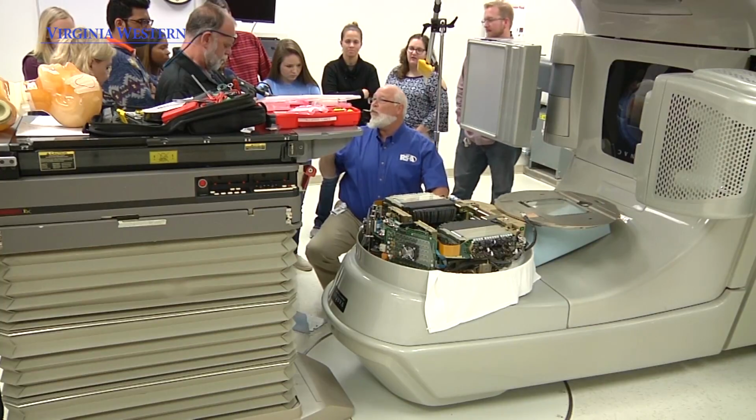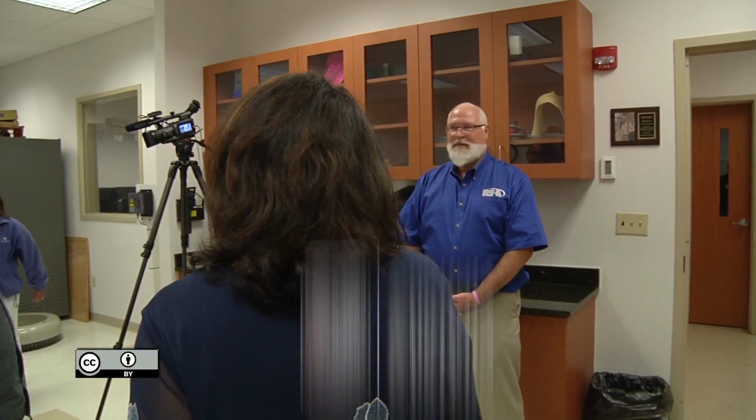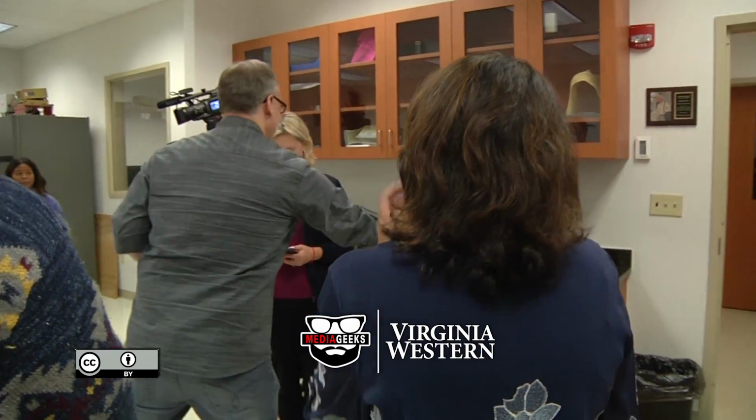Okay, who wants to hit WR on the keyboard? Everything worked and you're off treating your patients, and we'll call that a day for now. Thanks. And Randy, I'll get your screw out. Okay. Thank you.